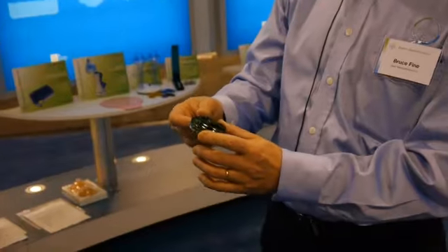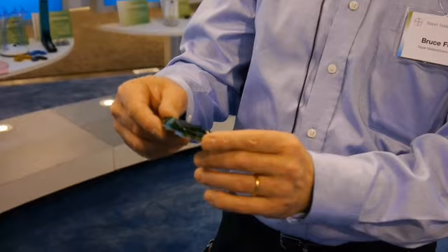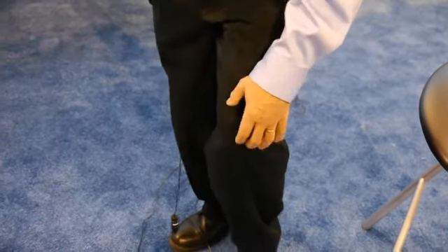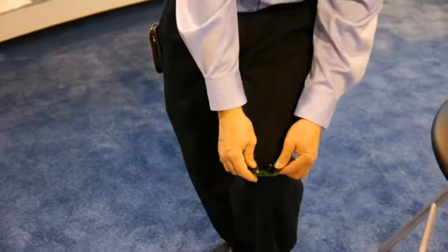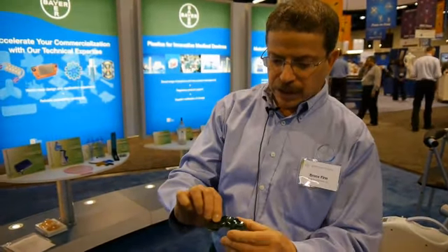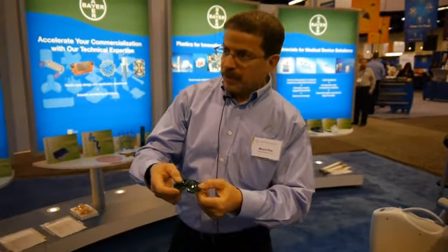This is an orthosensor device. This is used by orthopedic surgeons, and the purpose of this device is to exactly position the new knee that's being replaced, so it's loaded correctly, it's positioned correctly, the bearing is exactly as it needs to be. It's not an implanted device, it's more of a tool to help the surgeon exactly position the device. And this is our polycarbonate used here. It's tough, and then there's electronics and other components inside.